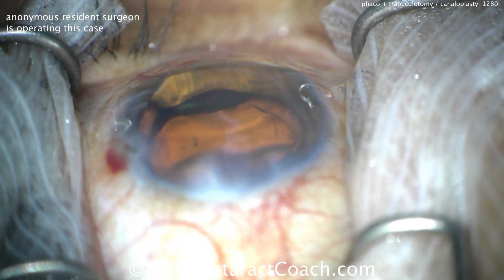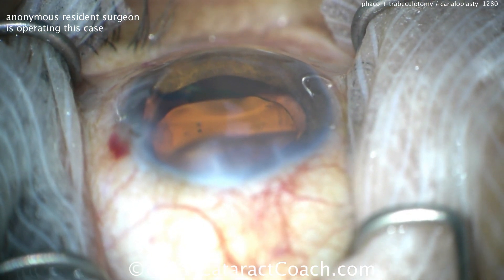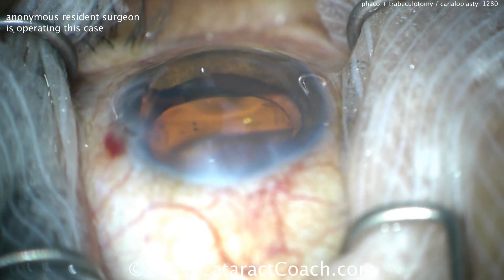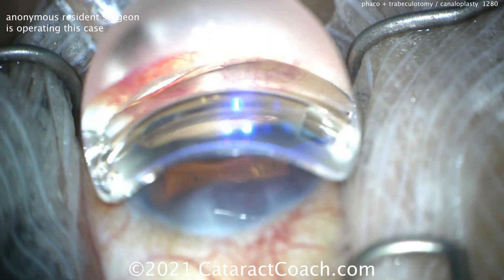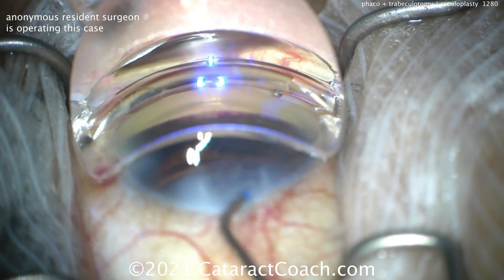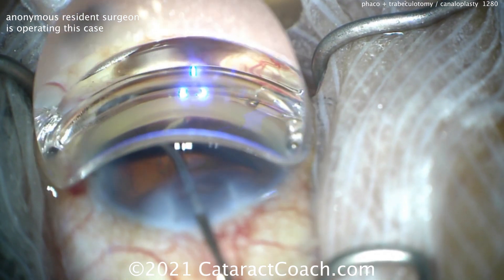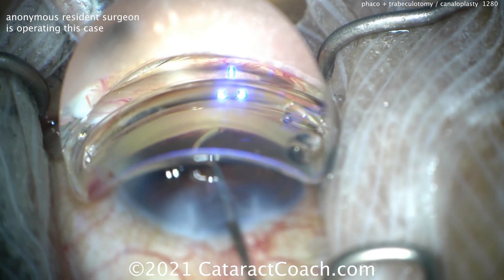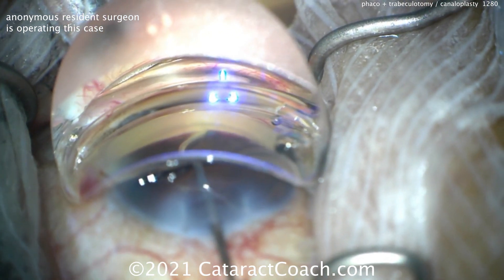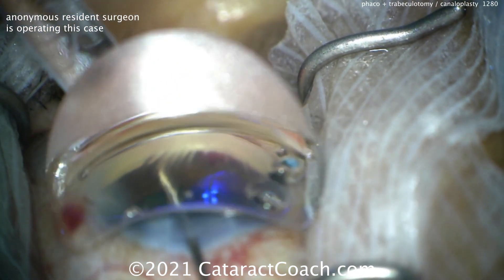Now to do the other side — you don't have to take off the gonio prism. We're going to go the other 180 degrees, so gonio prism going down again. If you need more viscoelastic, add it — you need to have a good view. Going in the other direction now with the same device, and there's still plenty of viscoelastic in it. As you place this, there should be really no resistance; it should go very smoothly if you're in the correct plane.